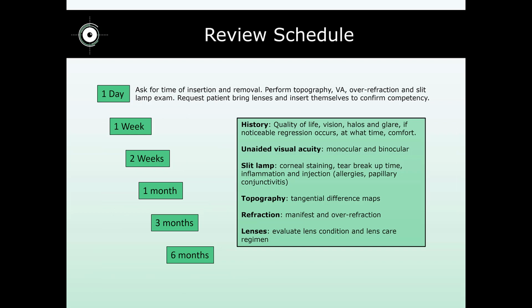Follow-up schedule. On day 1, ask for the time of insertion and removal. Perform topography, visual acuity, over-refraction, and slit lamp exam. Request that the patient bring their lenses and insert themselves to confirm competency.